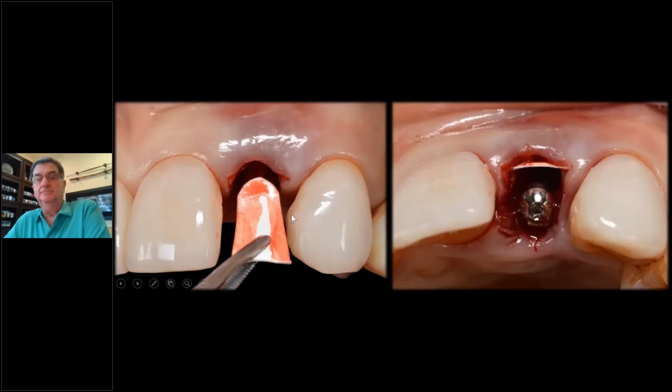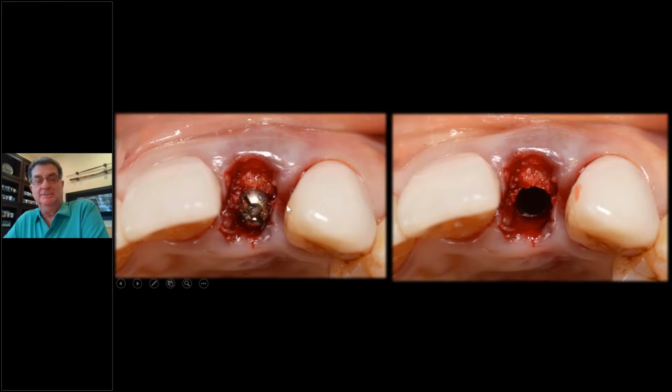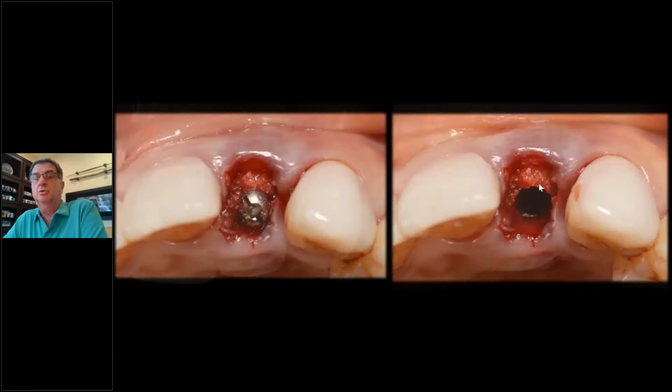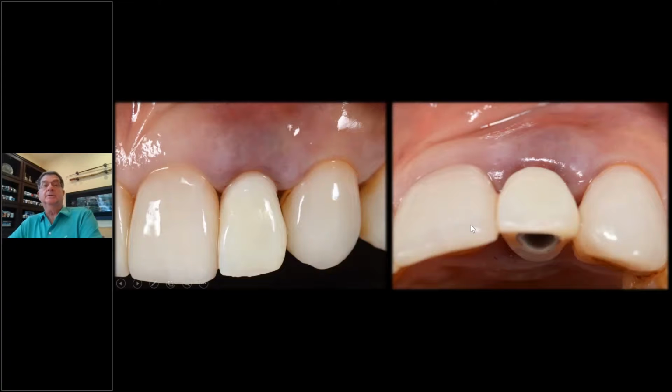I'm going to place it back in, and there's the gap, and I'm going to fill it with bone, with a straight cylinder in there, straight healing abutment. Here you see the graft being placed, pressed up, and you hold this in place, so moving in. Here you see the new graft, and then slowly take it out. Now you have the temporary made, you're going to squeeze it on, and you're going to push all this bone out and distend it up. And that's what I did here, as you see.